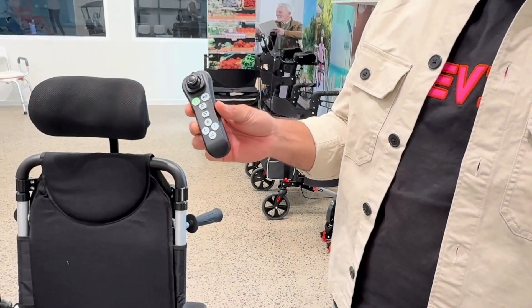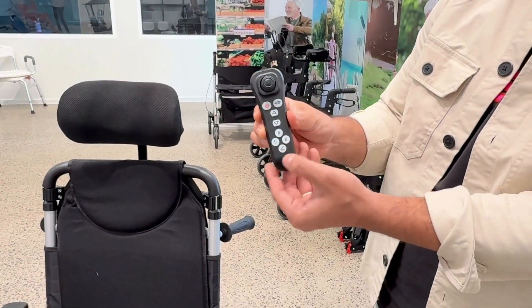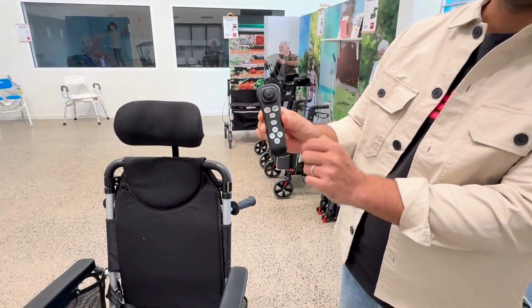You can also recline this wheelchair using this wireless remote — simply press the reclining button and use these arrows to recline the wheelchair.